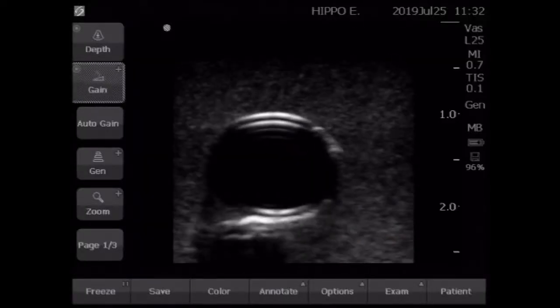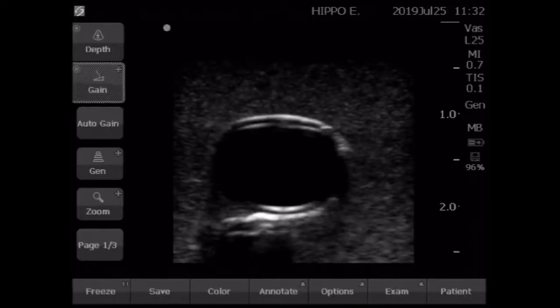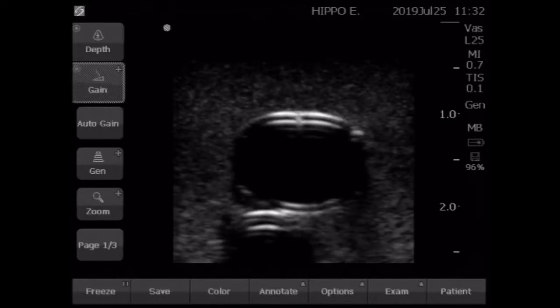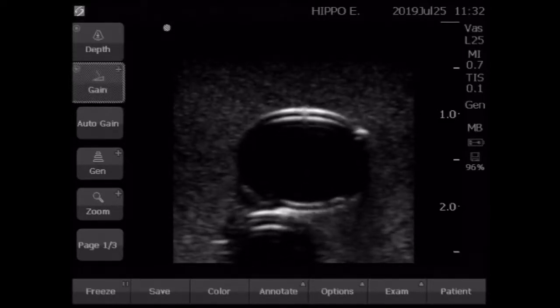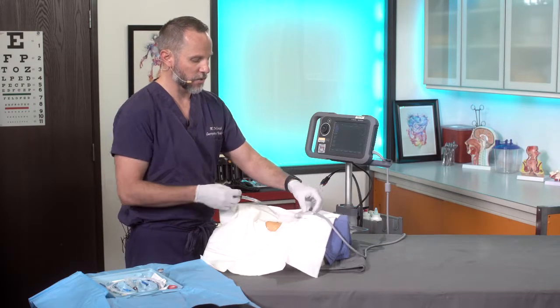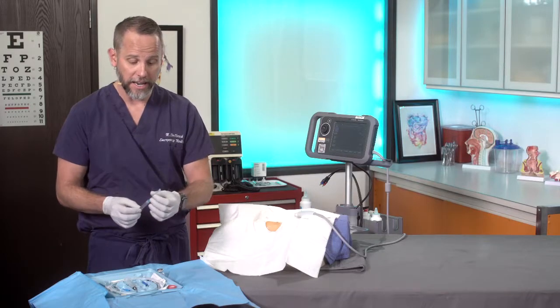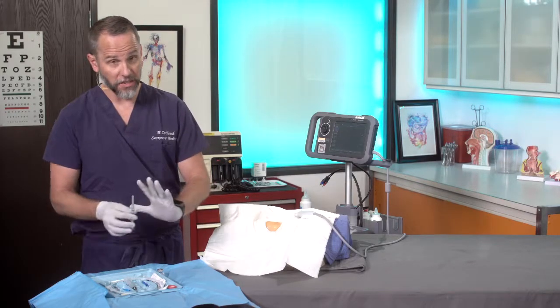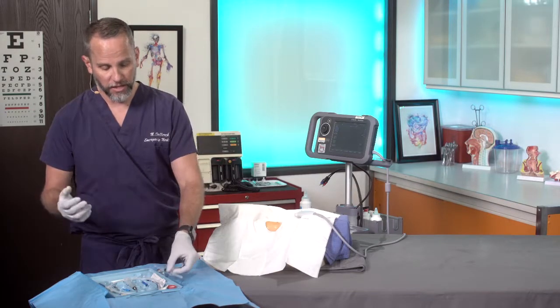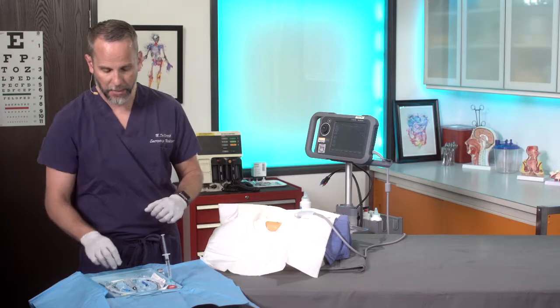When you're looking, you can see the course of your vein — the internal jugular vein. Hold your ultrasound with your left hand and do your skin wheal right in the course you're going to go with your finder needle. You can actually see your needle on that screen. If you're a little lateral, readjust your needle and you'll see it tapping on that vein — that's the tip of the needle. Don't anesthetize into the vein; go right above it and anesthetize the entire track. The part that really hurts is breaking through the skin, so that's the area to focus on. Also, do not recap your sharps on a live patient — put your needles in the needle holder instead.